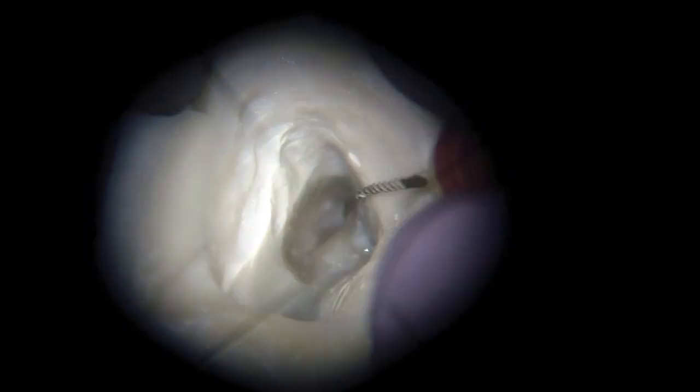The next step would be opening up the orifice and developing a straight line axis. Now I know exactly where my canals are going. Hope that helps — let me know if you have any questions and I'll try to answer. Cheers.